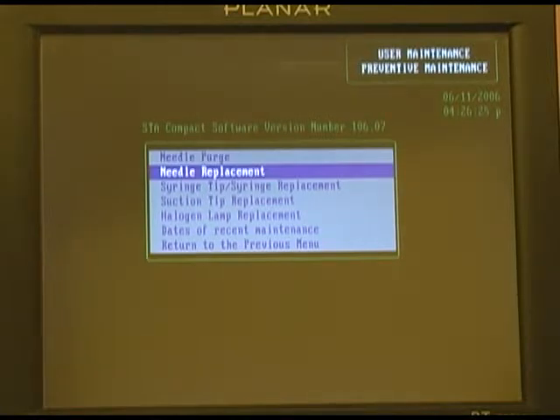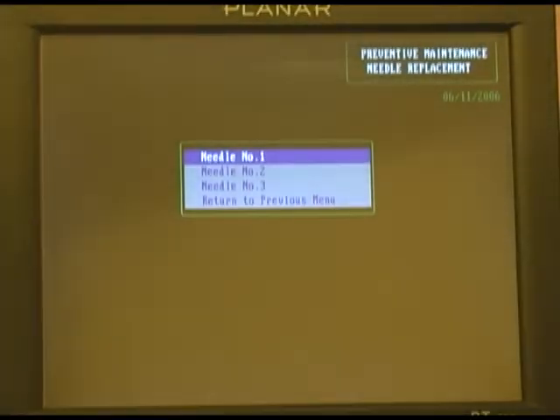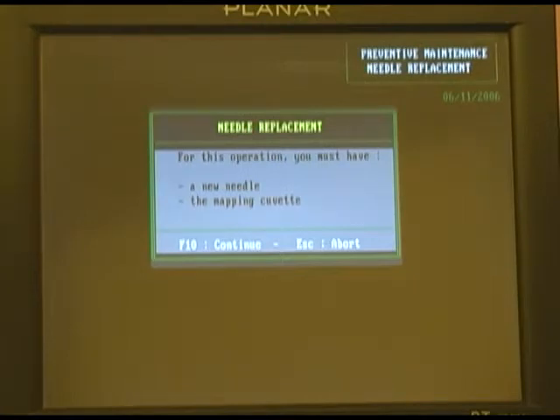First item we'd like to discuss is needle replacement. Needle replacement is required anytime you have a bent needle or a worn needle that's not producing the kind of results that you're comfortable with. The instrument will step you through the needle replacement procedure step by step. Just highlight needle replacement, press enter, select the needle that you wish to replace. It's going to say you must have a new needle and a mapping cuvette in order to facilitate this command. Hit F10 to continue.